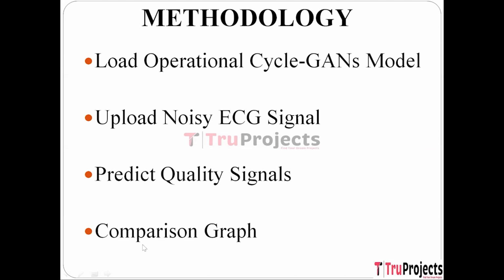And the fourth module is Comparison Graph. This module involves visualizing and comparing the results of the restoration process. It displays both the original noisy ECG signal and the restored clean ECG signal side by side, allowing users to observe the improvements made by the model. Additionally, the graph highlights the differences between the two signals, emphasizing the effectiveness of the restoration process.